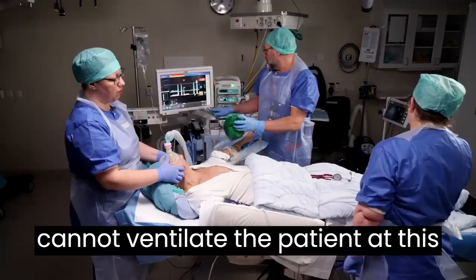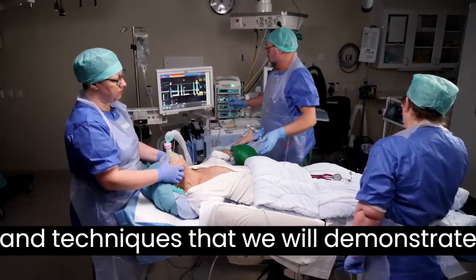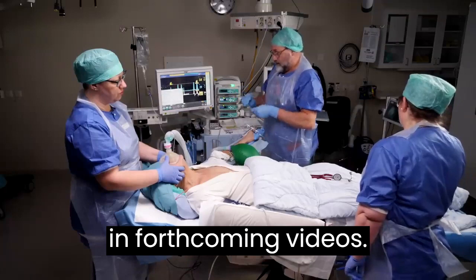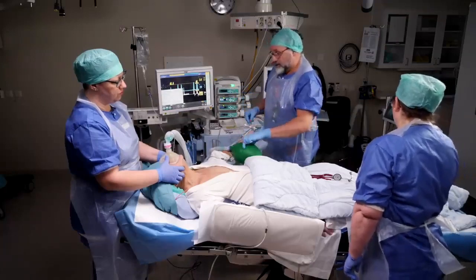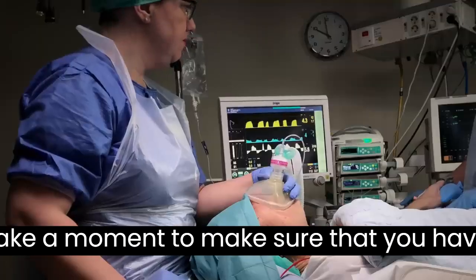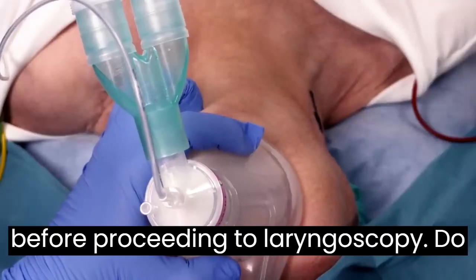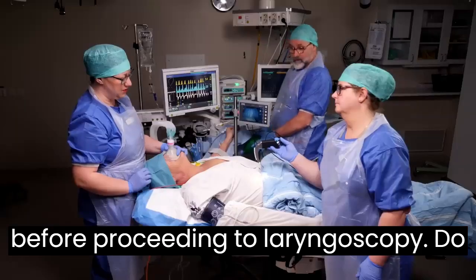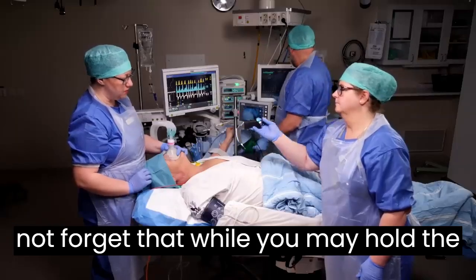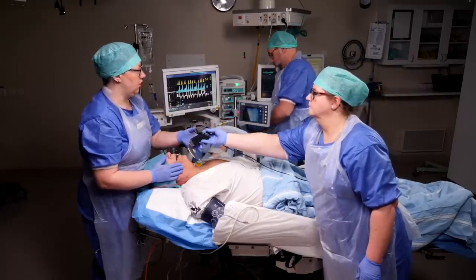If you cannot ventilate the patient at this point, you need to use other equipment and techniques that we will demonstrate in forthcoming videos. While you wait for full onset of the drugs, take a moment to make sure that you have achieved absolute optimal positioning before proceeding to laryngoscopy. Do not forget that while you may hold the blade, this is very much a team effort.